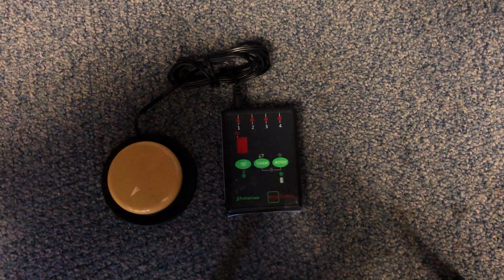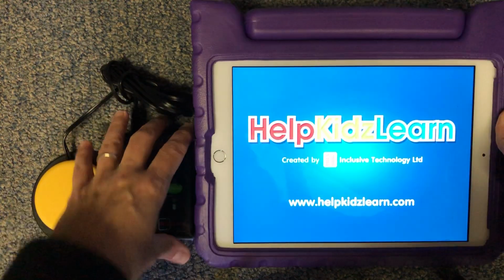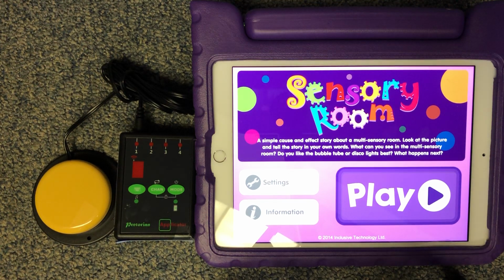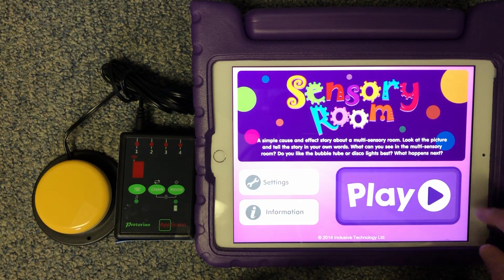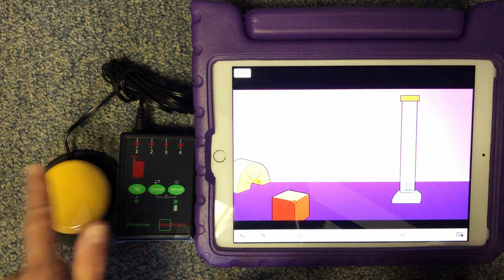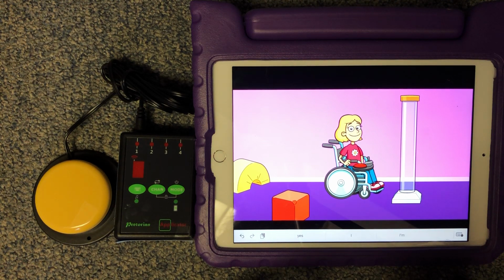I'm going to go to an app called Sensory Room, and the reason I chose this one is just because I went online and tried to figure out what is a good app to use for switch access, and this one was recommended. I'm going to go to settings. I'm going to go to enable switch because this particular app was made specifically for switch access. I'm going to hit that. I'm going to go to play. And now I can hit my switch to make things happen on this particular app.